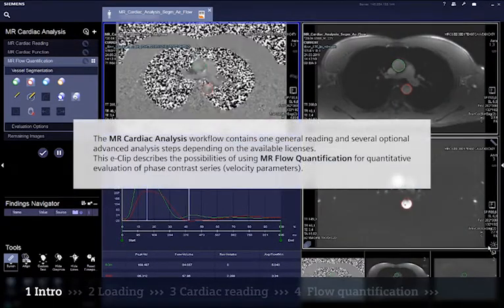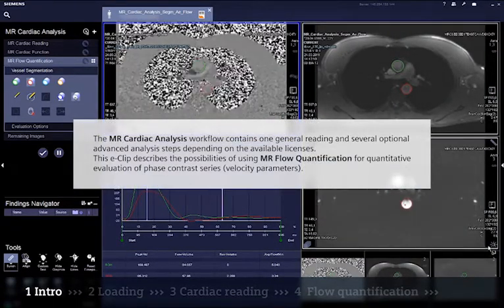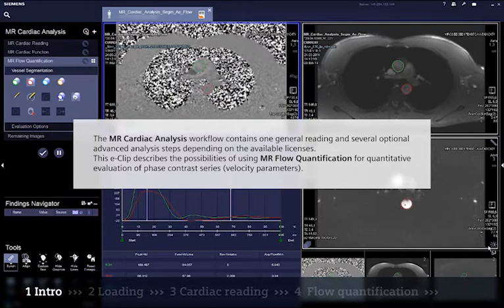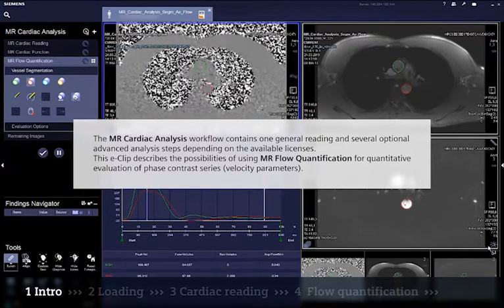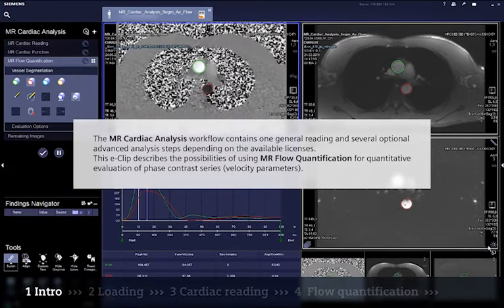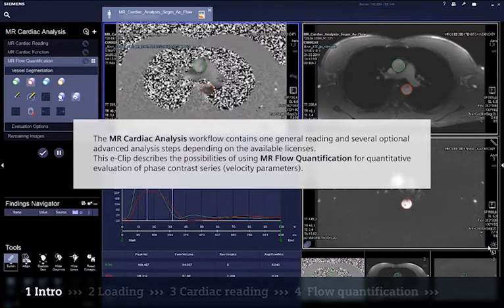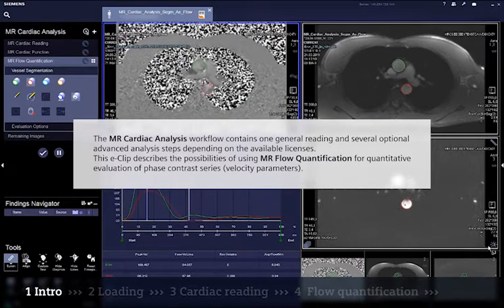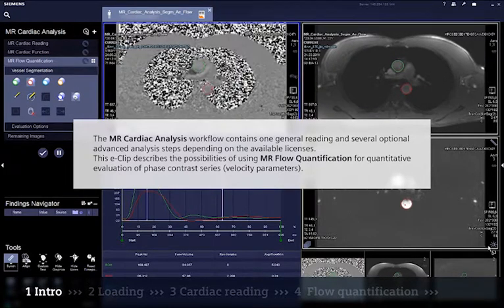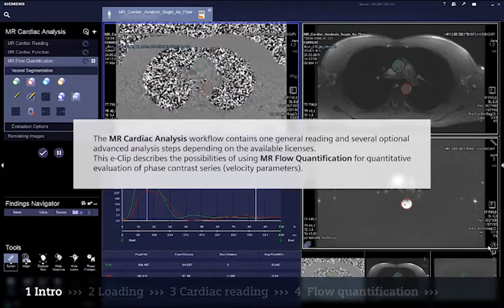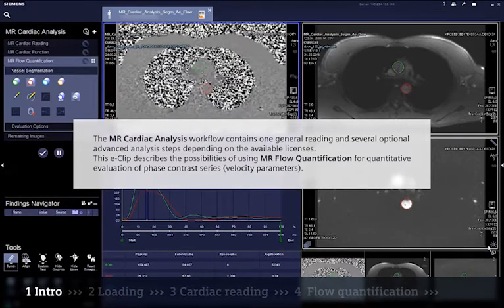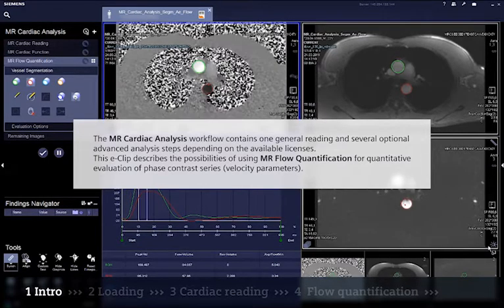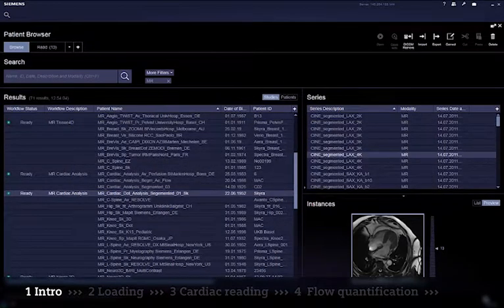The MR cardiac analysis workflow contains one general reading and several optional advanced analysis steps depending on the available licenses. This eClip describes the possibilities of using MR flow quantification for quantitative evaluation of phase contrast series velocity parameters.